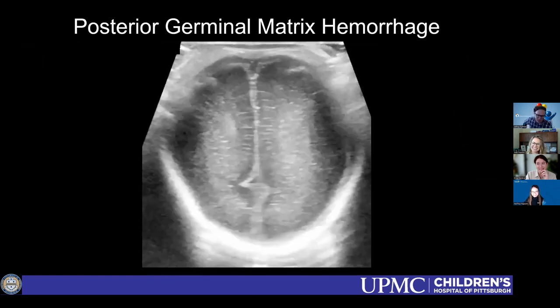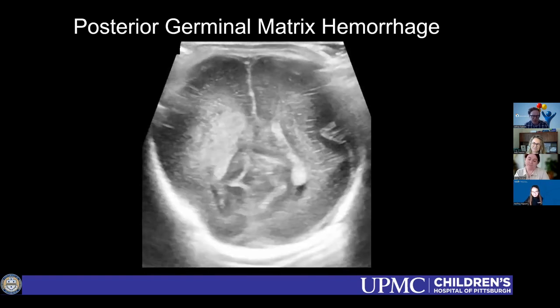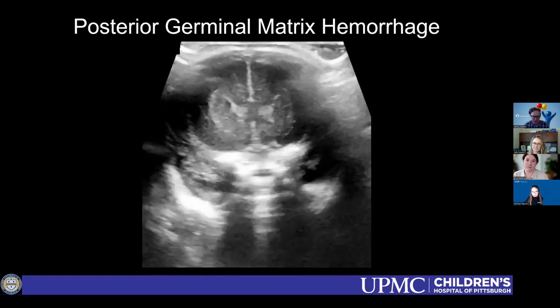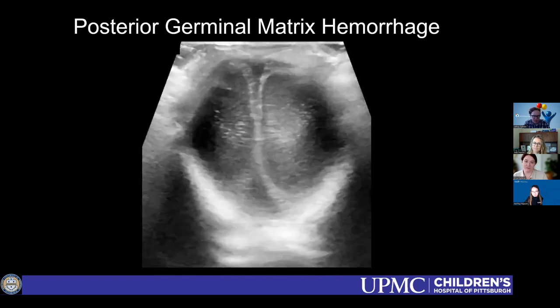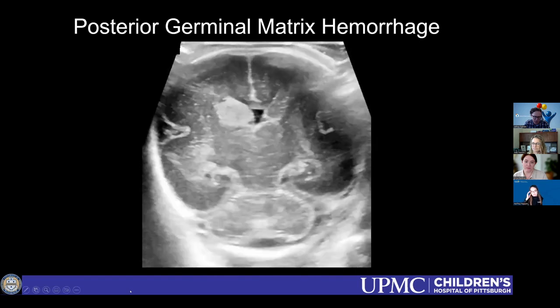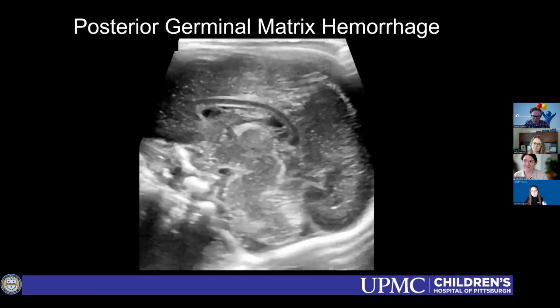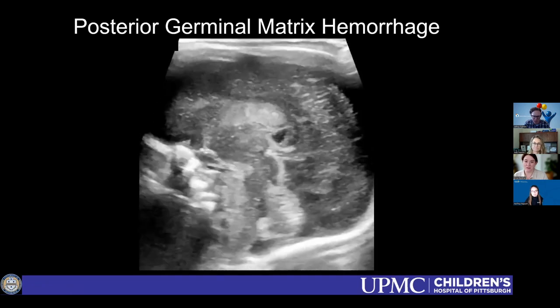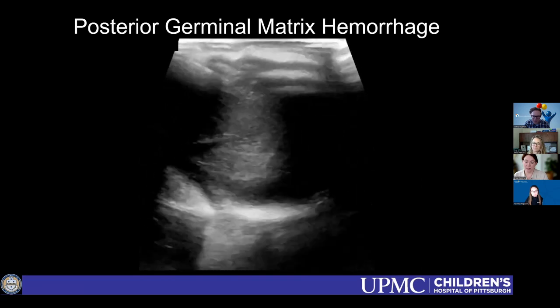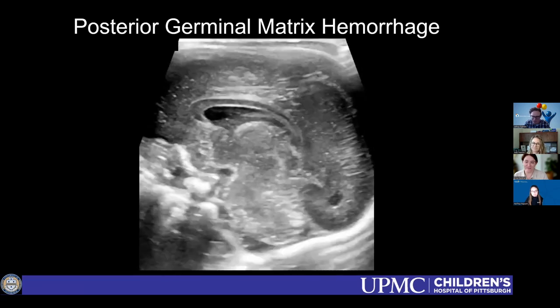Yeah, no, I think this is definitely a challenge. And like you said, I don't think that we have accurate literature and grading scheme to really capture this. This particular article was discussed at one of our departmental journal clubs within the last year or so, shortly after the article came out. And that was one of the conversations that came out of this. Technically this is a grade 1, but just looking at the volume of blood in there, it kind of feels weird to call it a grade 1. So I don't have a great answer to your question.